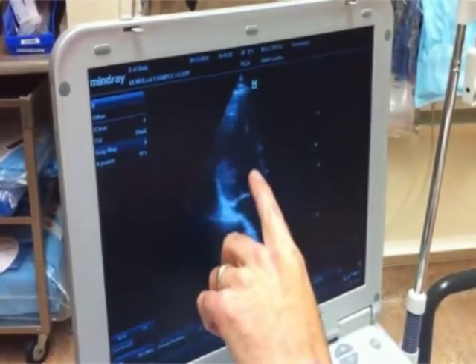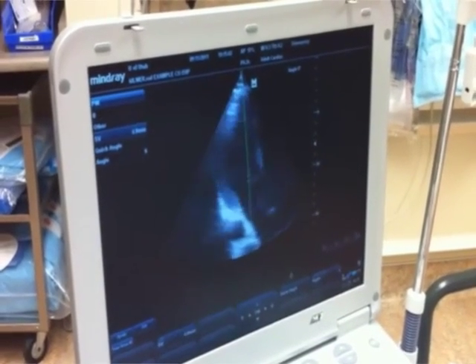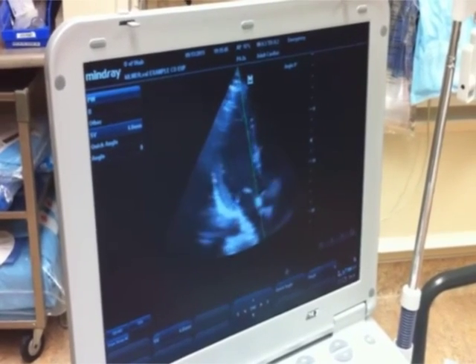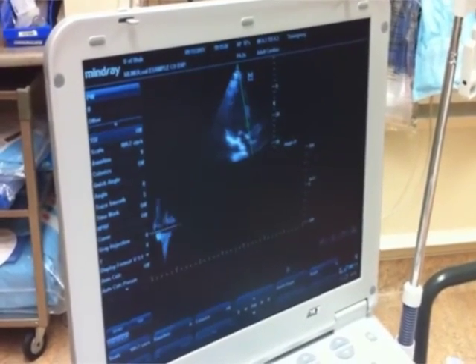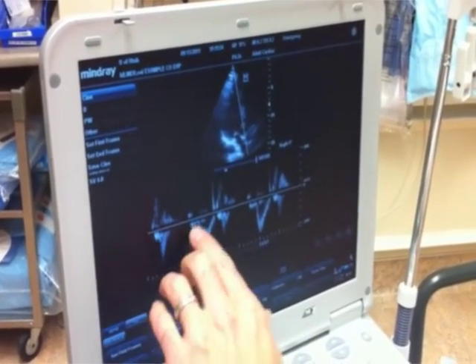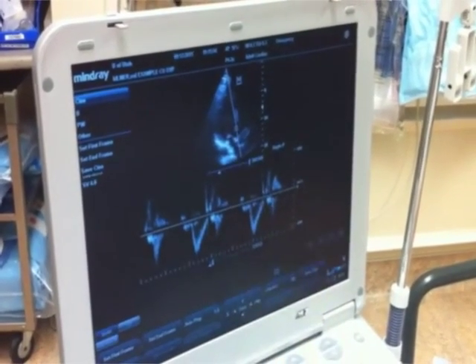What I'm going to do is measure the velocity of the blood cells going through this left ventricular outflow tract. So here I'm going to hit pulse wave, put the pulse wave gate just apical to that aortic valve, and hit pulse wave again. Now what we have is the velocity of blood cells as they're going through the left ventricular outflow tract.